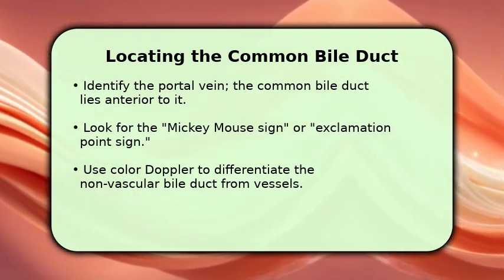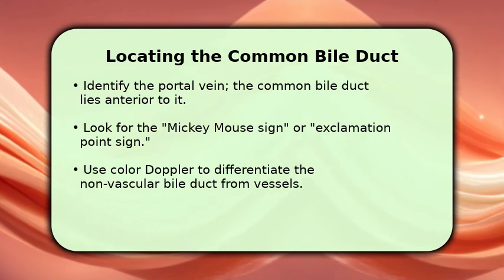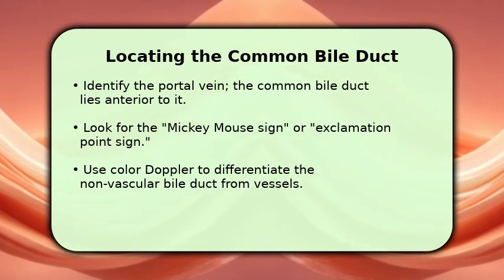Always apply color Doppler to confirm the common bile duct, as it will not show blood flow, unlike the adjacent hepatic artery and portal vein.